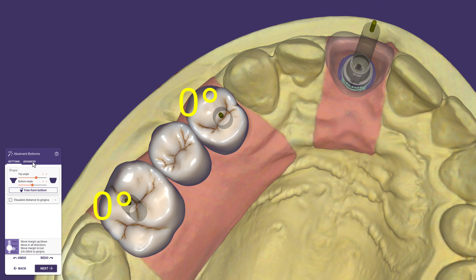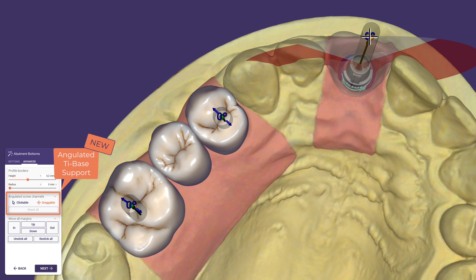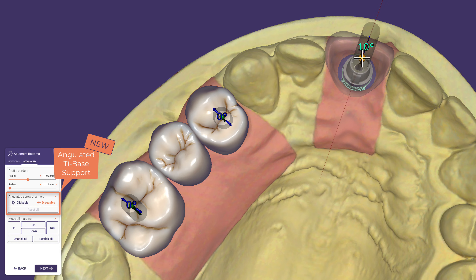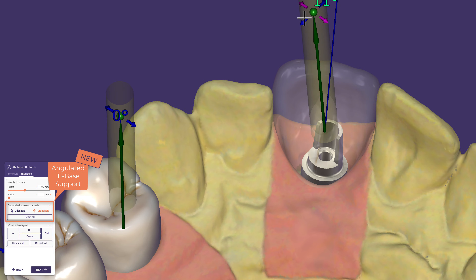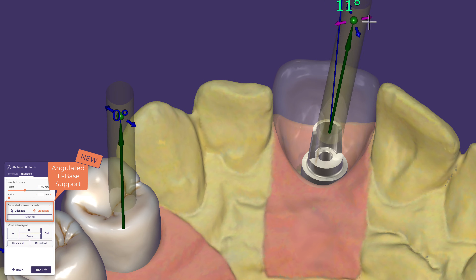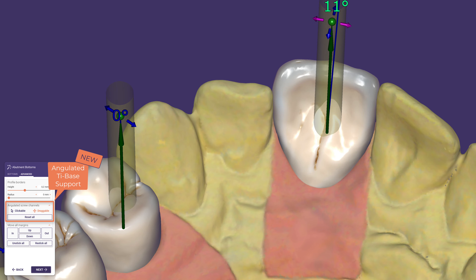We added a much easier way to use tie bases designed for angulated screw channels on selected implant libraries. As you can see, the tie base interactively changes position when dragging the screw channel, taking the implant interface into account. This lets you focus on your design, especially with these challenging cases.